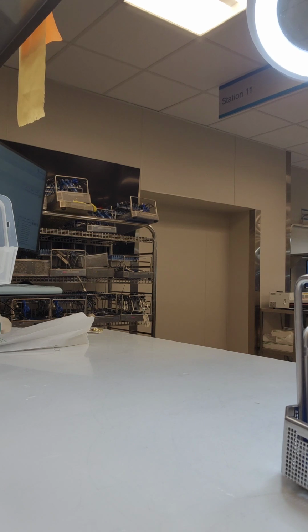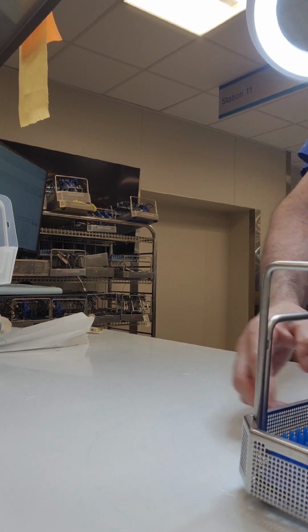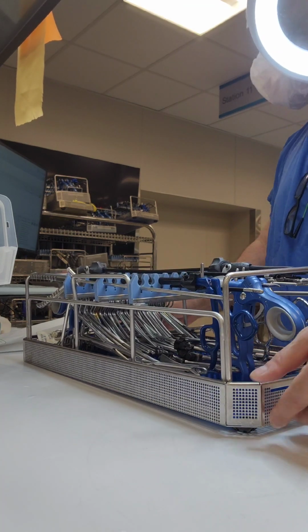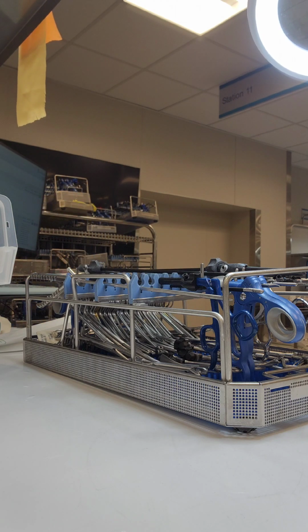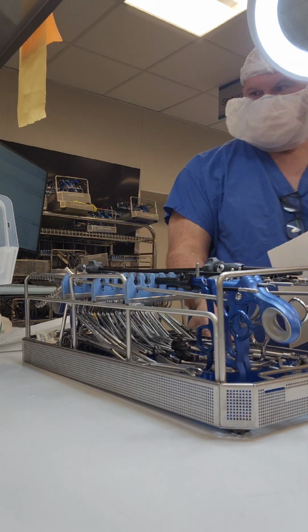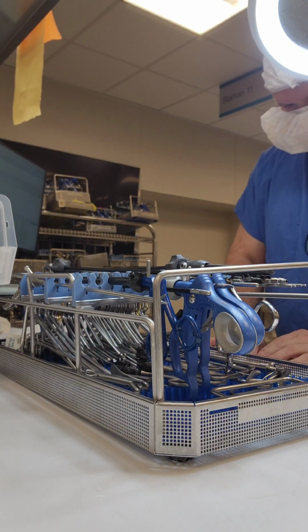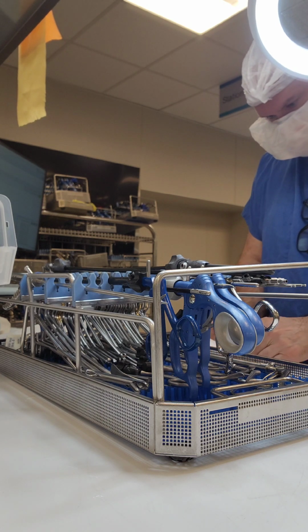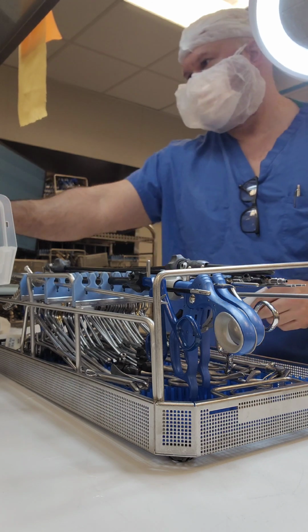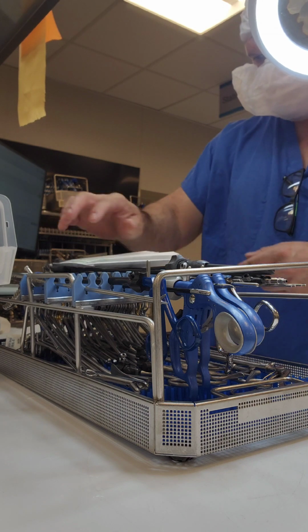There you go. Placing the rack in that basket. And here you go, putting it off to the side. Now, there's another thing I want you guys to notice here. If you look at the basket in the bottom, you notice that the far side does not have one of the little feet. Those feet are actually important on these baskets. They keep that basket off the bottom of the container so that any moisture sits underneath that basket and is not soaked through your liner, whatever you got in there.